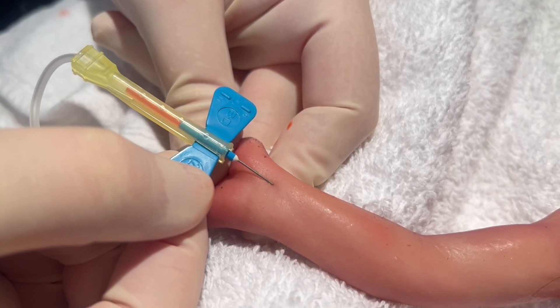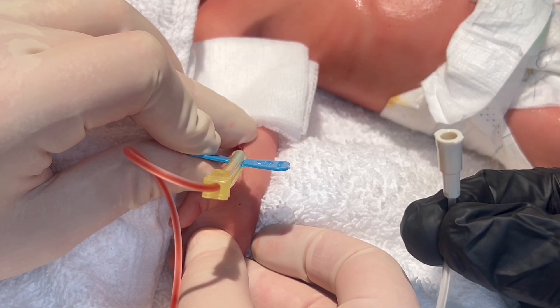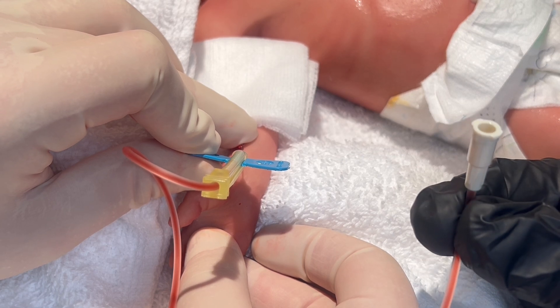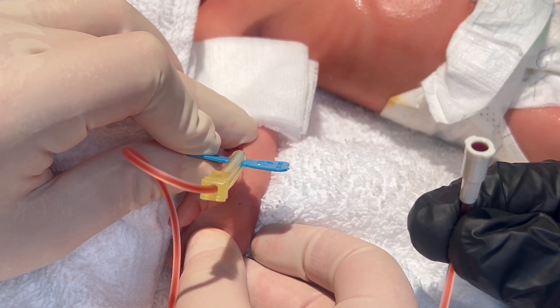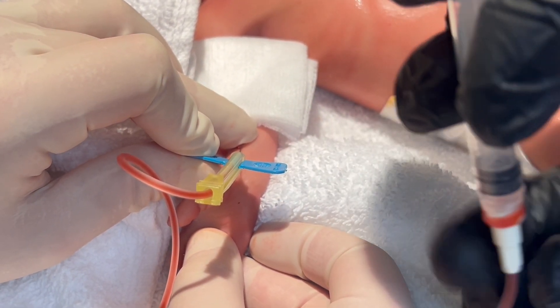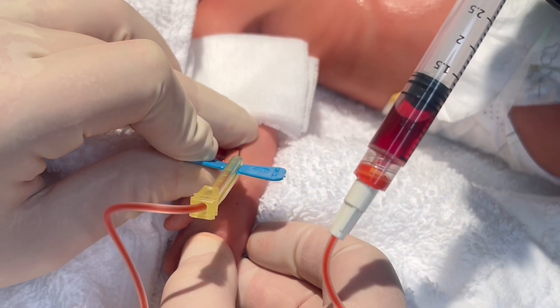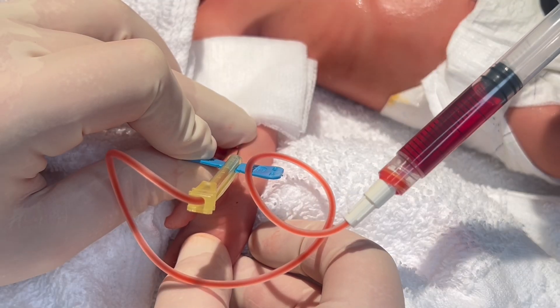Once blood return is seen, stop advancing the needle and hold that position. Allow the blood to slowly flow back via arterial pressure until it reaches the end of the hub. At this point, you can then attach your syringe and slowly withdraw without collapsing the vessel until you have reached your desired amount of blood.